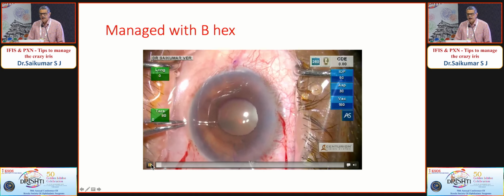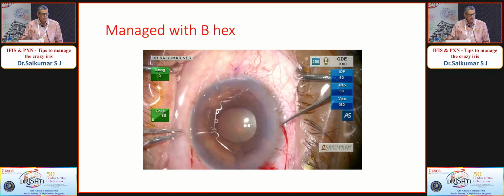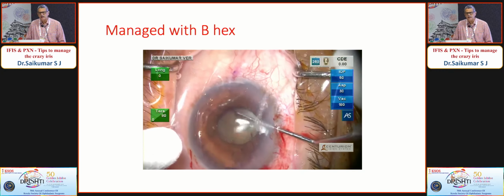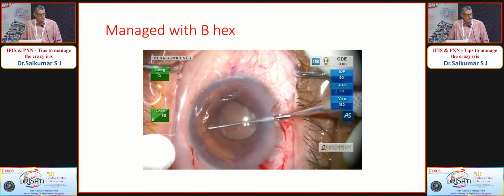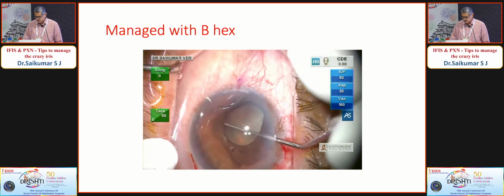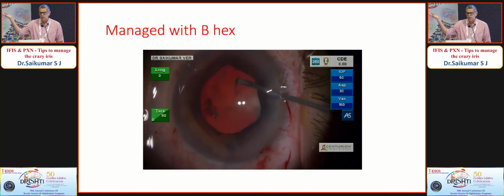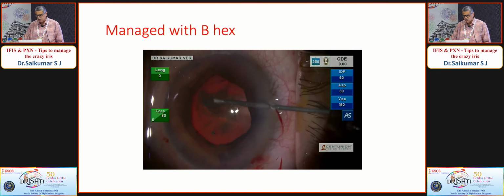B-hex ring. I use a micro forceps which is used by our retina surgeons to put in the ring. Just put in the ring like that, and then use a dialer to tuck the ring under the iris. This is the technique that I use. This technique is good in my hands, although there are some forceps that are described by Suven for placing these rings under. I generally use the microrhexis forceps the VR surgeons use and probably discard, and you can take it, and even for removal you can use that. So the iris remains well there.